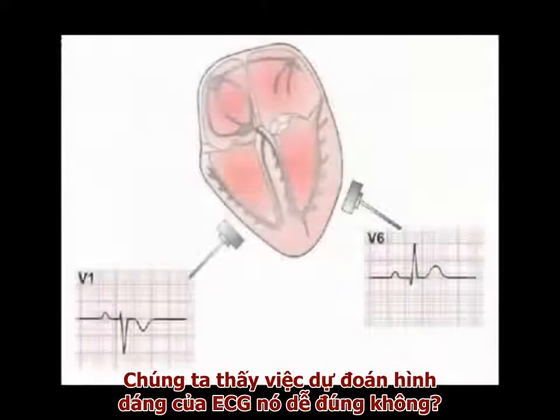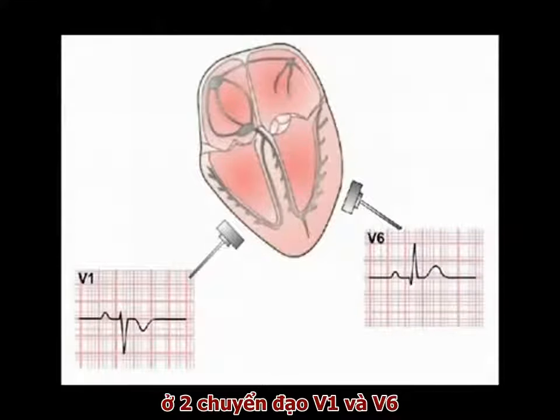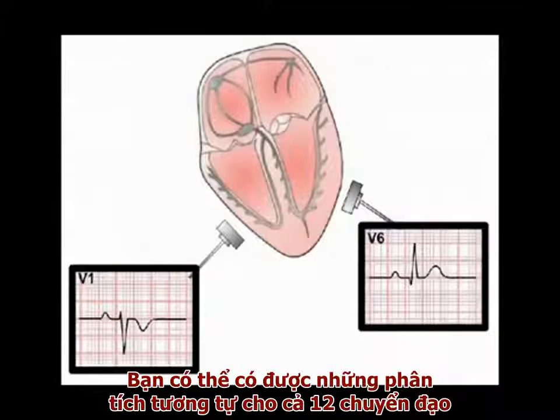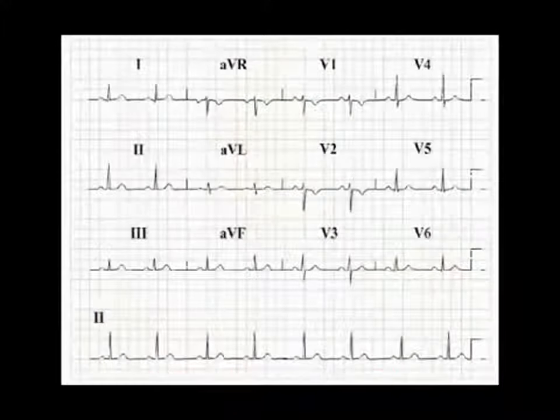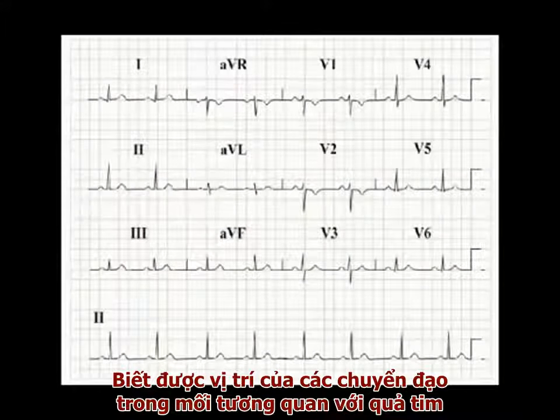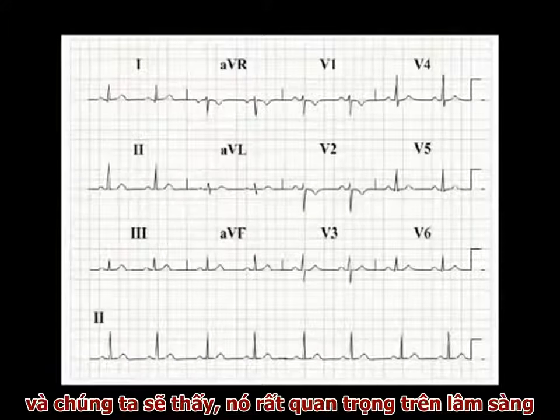Seen how easy it is to predict the form of the ECG readout in two of the chest leads, V1 and V6. If you know the position of each of the 12 leads of the ECG relative to the heart, you can carry out a similar analysis in all 12 leads and build a predicted ECG. Learning the position of the leads of a standard ECG relative to the heart is not as difficult as it sounds, and as we'll see later, pays dividends in clinical practice.